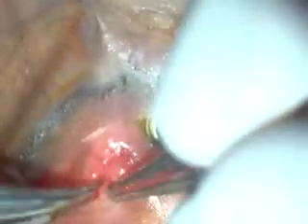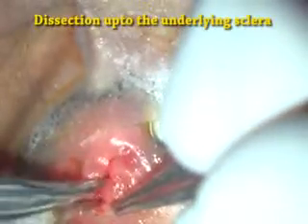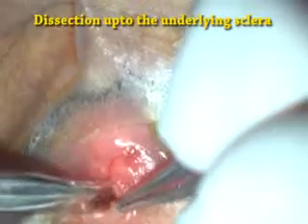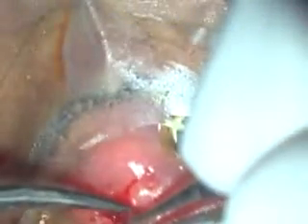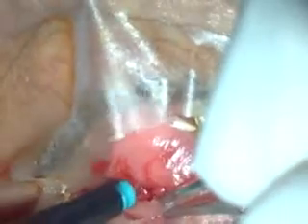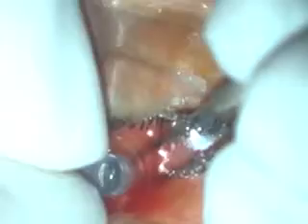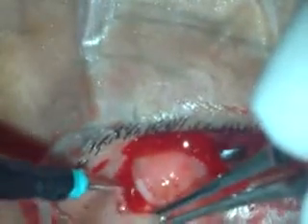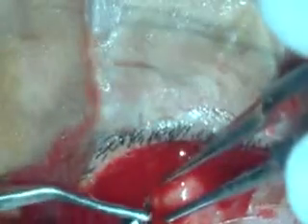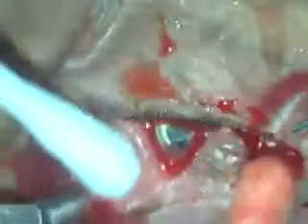Microcannulae for cutter and infusion are placed after incising the mucous membrane graft to expose the underlying sclera. A third port is then similarly made for the 19-gauge microendoscope.